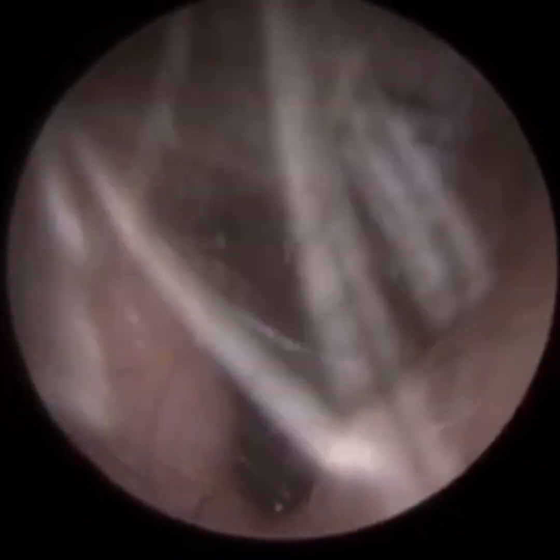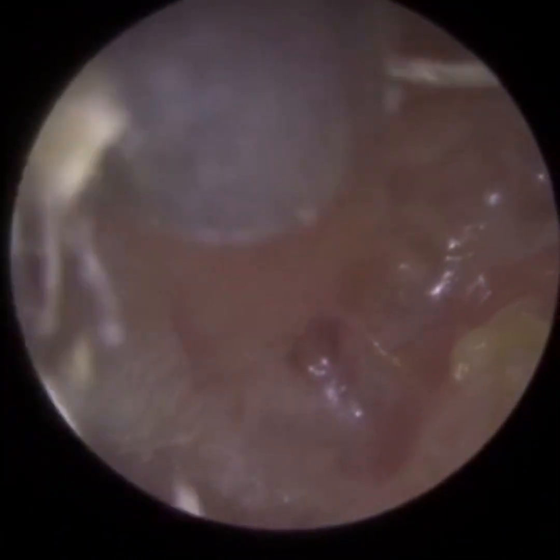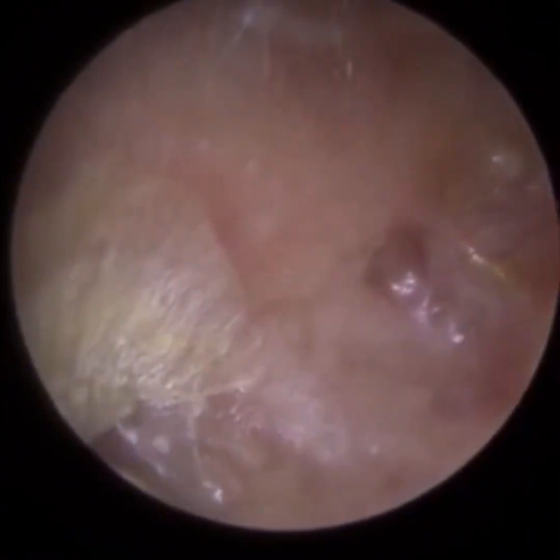So when is a mastoid operated on? It's going to come back to the video very quickly. What you've been watching for the last 5 minutes, that's not the patient's normal ear canal. This is all on the left-hand side. That's the mastoid cavity. And onto the right, I will make an effort to direct you when we're back into the normal ear canal. But all this is extra. You don't normally see this in someone's ear. All this you've been watching, it's all in the mastoid.